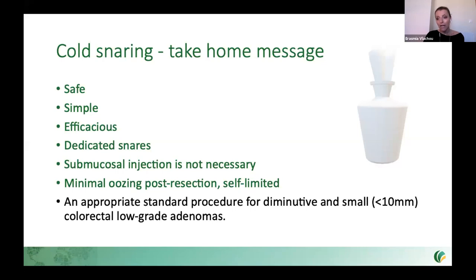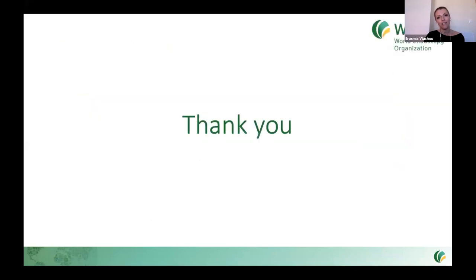So with this in mind, there is now emerging evidence that even large sessile serrated lesions with no evidence of dysplasia could be considered candidates for piecemeal resection by cold snaring, and even pedunculated polyps. So I think that in the future, there is a lot to be seen. Thank you.